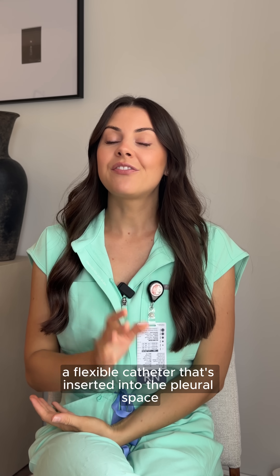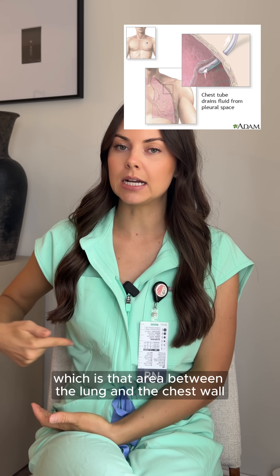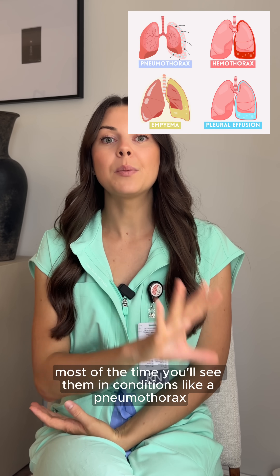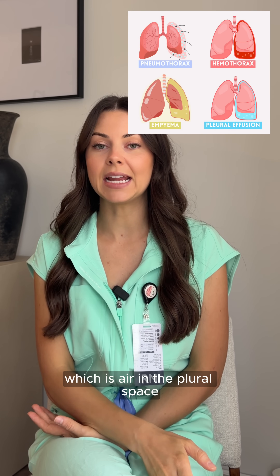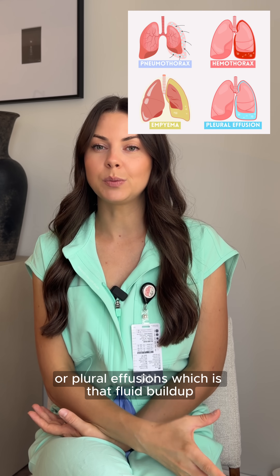A chest tube is basically a flexible catheter that's inserted into the pleural space, which is that area between the lung and the chest wall. Its job is to remove air, blood, or fluid that shouldn't be there. Most of the time you'll see them in conditions like a pneumothorax, which is air in the pleural space, hemothorax, which is blood in the pleural space, or pleural effusions, which is that fluid buildup.